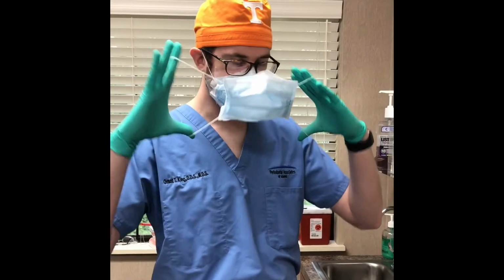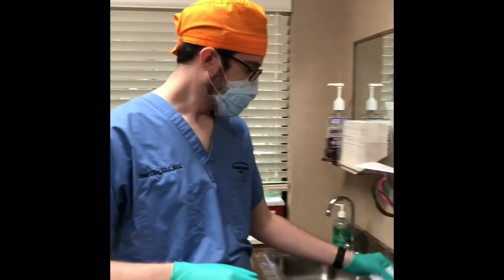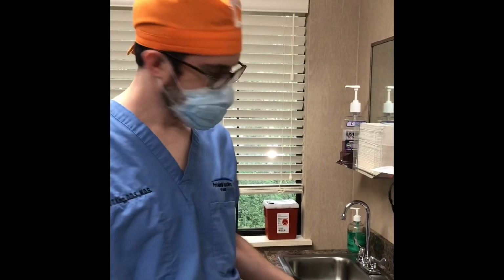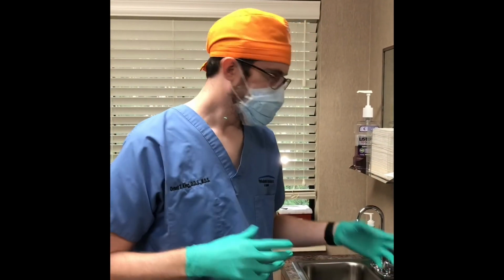Just put it on like a normal mask, like I got this one on, and then what we're using is some of the skin tape. Basically go around the outsides and tape it and seal it. So this will be the mask that you wear around all day, and then you can get another mask that you'll wear between patients that basically gets any splatter and things like that.